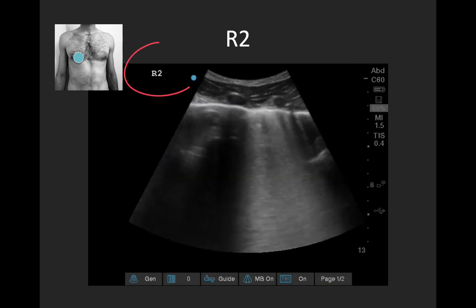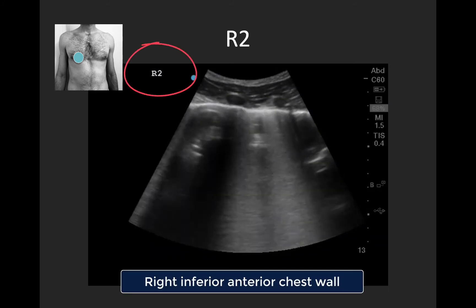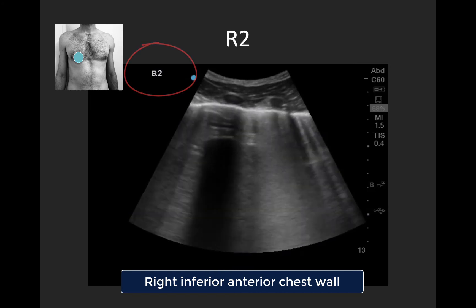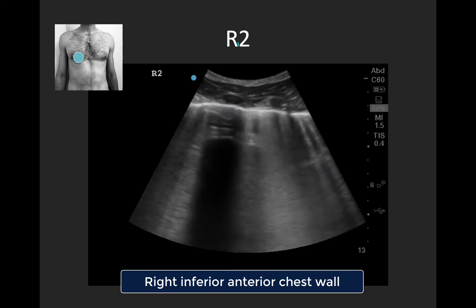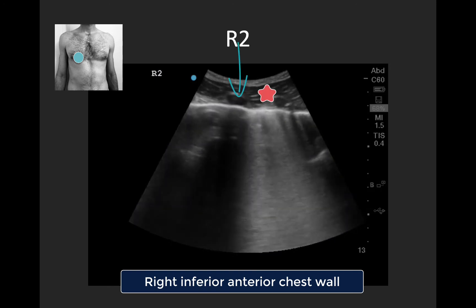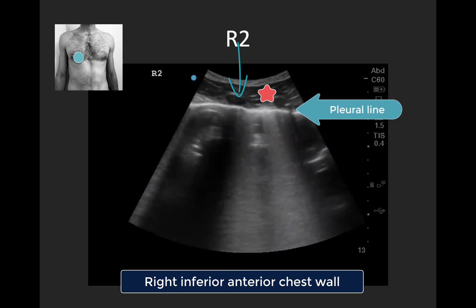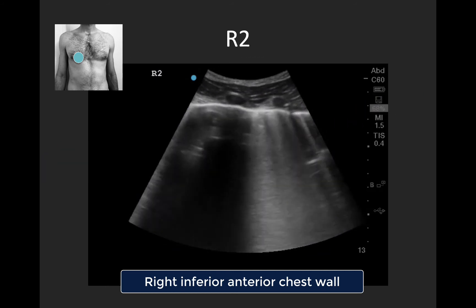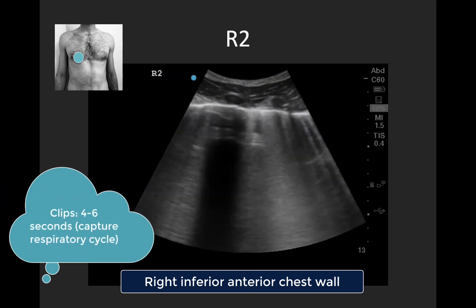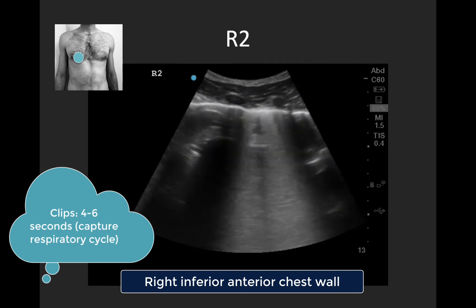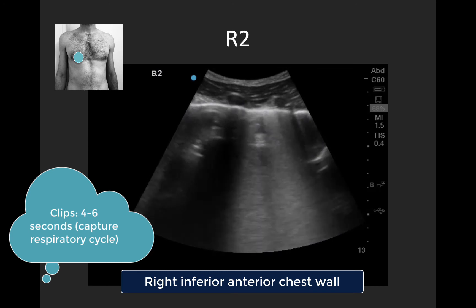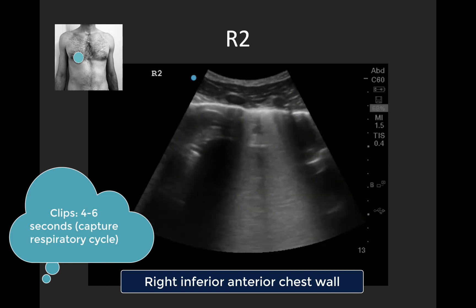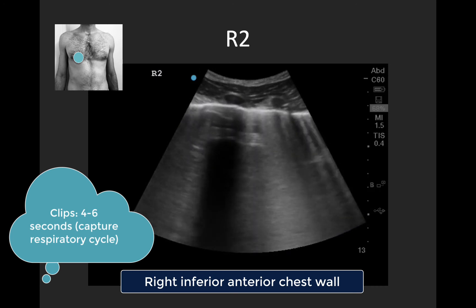Moving on to R2 — the right inferior anterior chest wall, again around the mid-clavicular line, farther down the chest, typically around the fifth or sixth interspace at or just below the level of the nipple. We can see rib shadow with an interspace in between, a nice bright pleural line lying fairly flat, and again many vertical hyperechoic B-lines extending down from the pleural line and moving with respiration. Regarding clip length: with lung ultrasound, clips should be between 4 and 6 seconds long, long enough to capture a full respiratory cycle, as movement of artifacts with respiration is a key feature we look for.